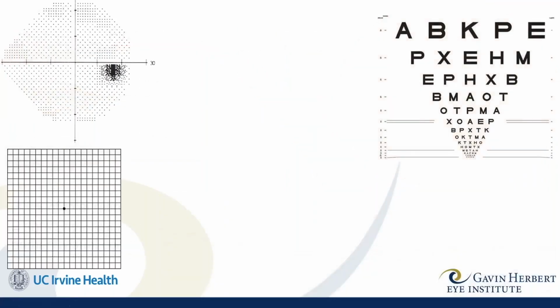When we talk about measuring visual function, so much of our effort is put into visual acuity testing. And here we see an ETDRS chart, which is the gold standard for clinical trials for visual function, especially in diseases affecting the retina. We, of course, also have the visual field exam, where multiple points across the retina are tested for sensitivity. And then there's also the Amsler grid.